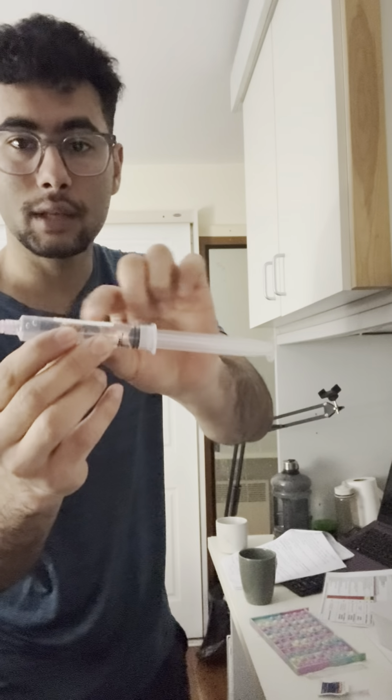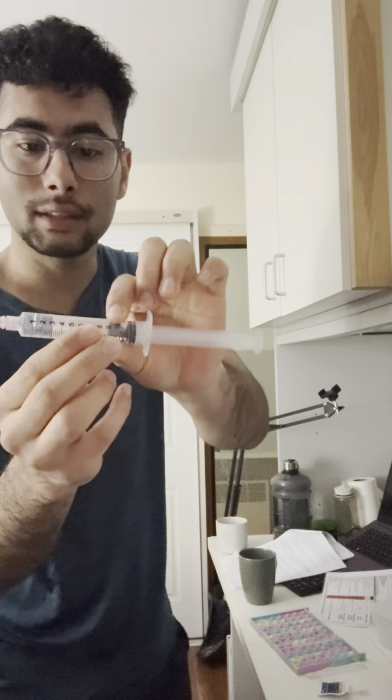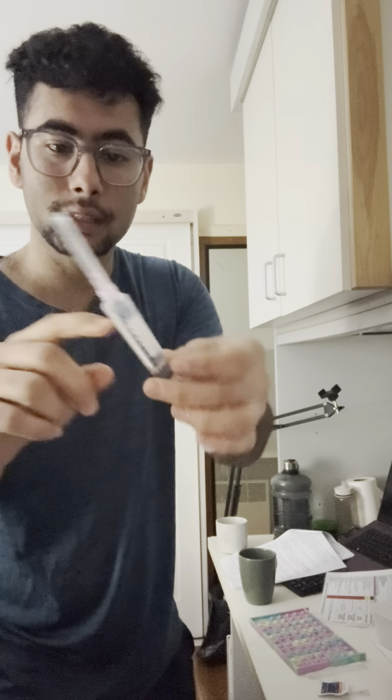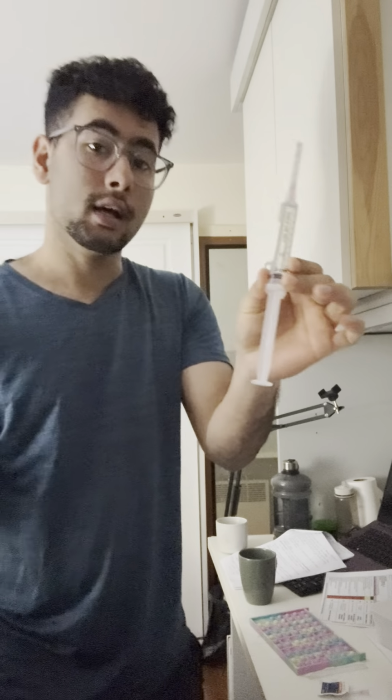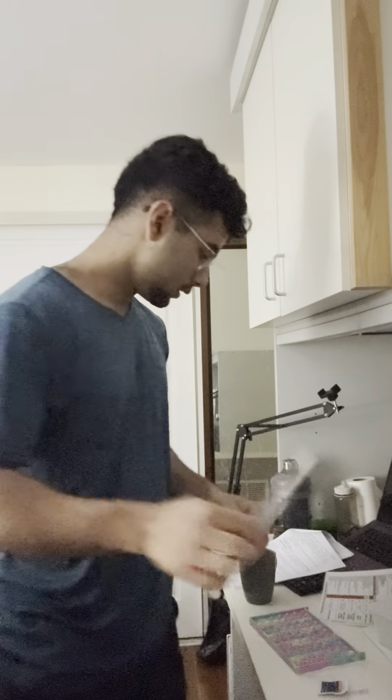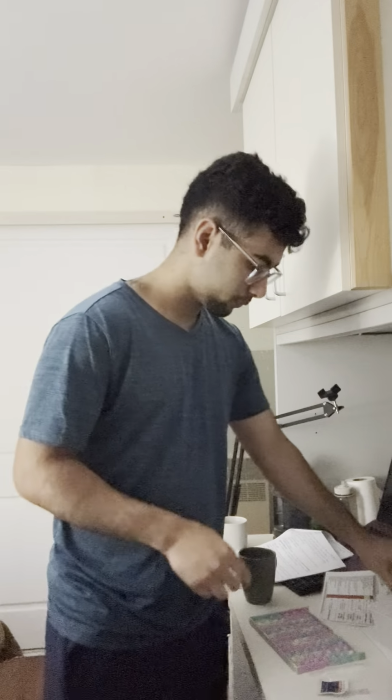I have already done it. Always make sure that the labeling you are doing never touches this line. Make sure it's always on the sideline, so that you are not missing things out and you are able to read the readings properly. So that's done, I'll put it aside. This is ready for the flush. I'll put it here. Cool.